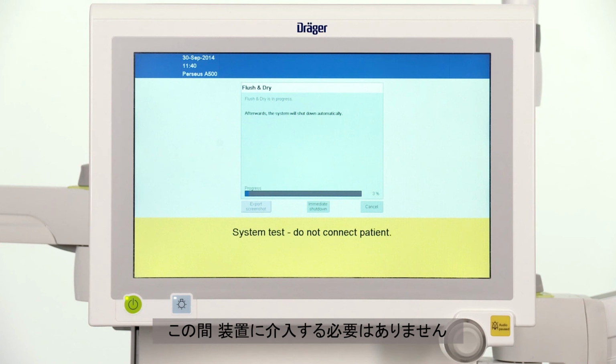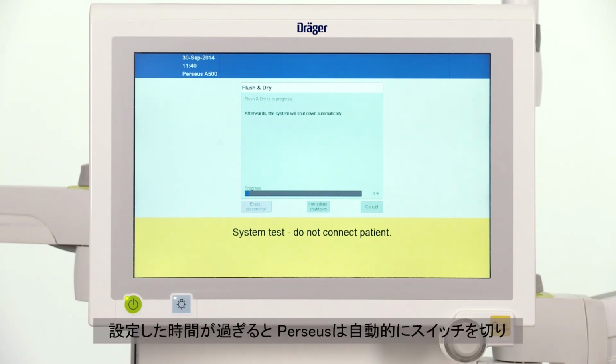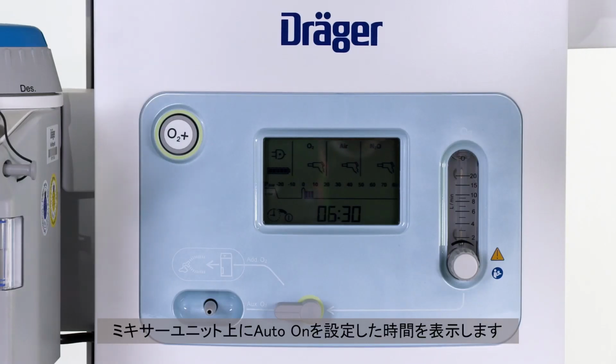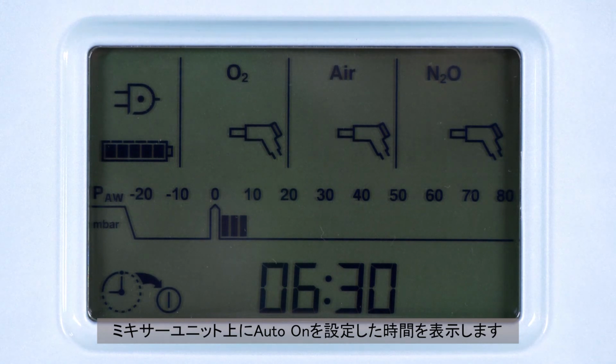During this time, no intervention on the device is required. After the set time, Perseus will switch off automatically and be ready for the self-test morning routine. The mixer unit displays the time you've selected for the device to be operational.